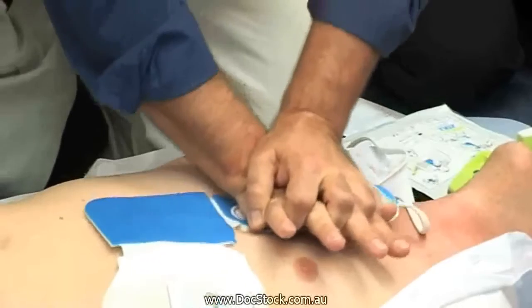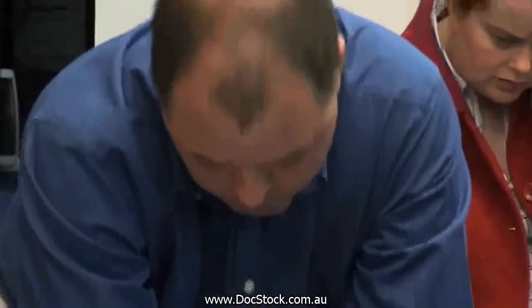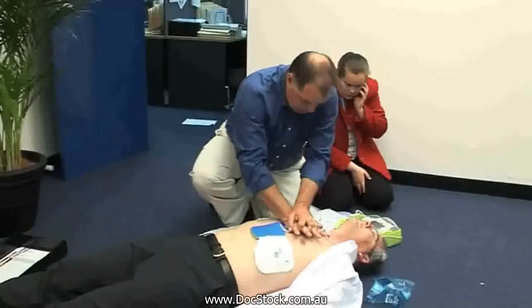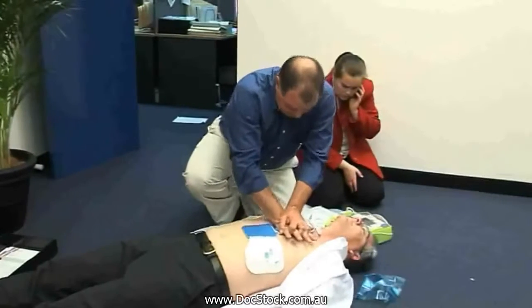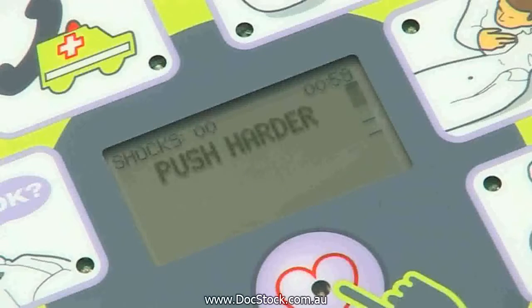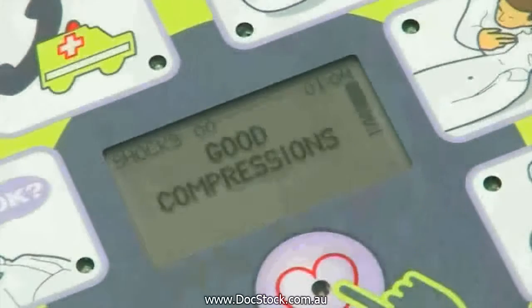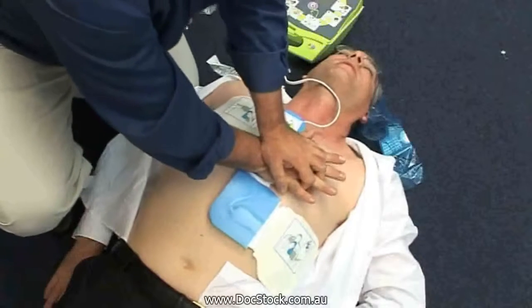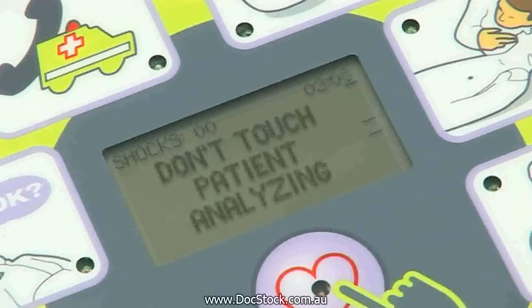If there is no sign of circulation, the unit will advise you to commence CPR. Place your hands on top of the CPR sensor and push down to deliver chest compressions. The AED Plus metronome will begin issuing timing beeps — try to maintain synchronization between the beeps and your chest compressions. The display shows how deep you are compressing. If you do not compress hard enough, the AED will tell you to push harder. Each compression should fall between the small lines, representing four to five centimeters in depth. After two minutes of CPR, the AED Plus will then analyze the patient's heart rhythm.